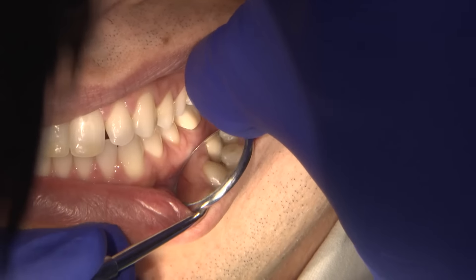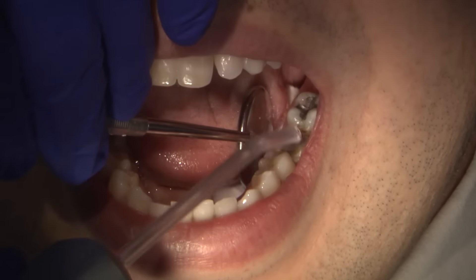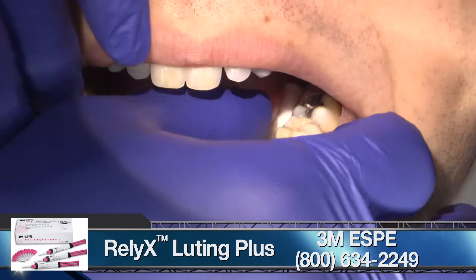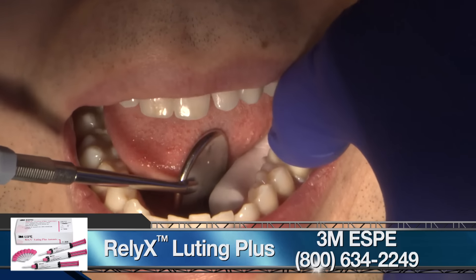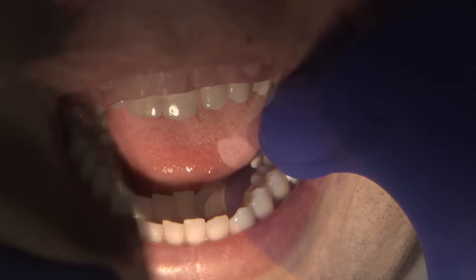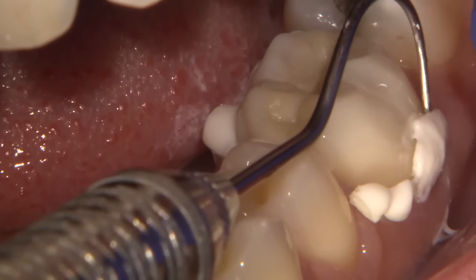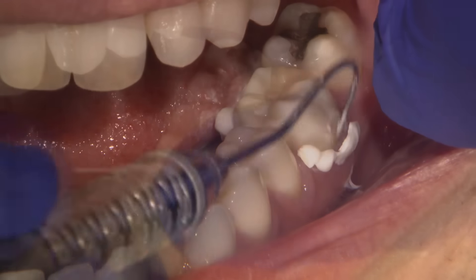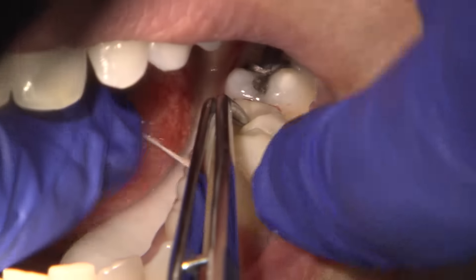I do see an enhanced aesthetic appearance on this new restoration, so I'm sure the patient will be happy. For cementing this restoration, we're using the 3M Relyx Luting Plus, which is a resin-modified glass ionomer. After about a couple of minutes in place, we can begin cleaning off the excess cement. It gels fairly quickly within two minutes, and using an explorer, I gently tease the excess off, and then with floss, clean out the interproximal areas.